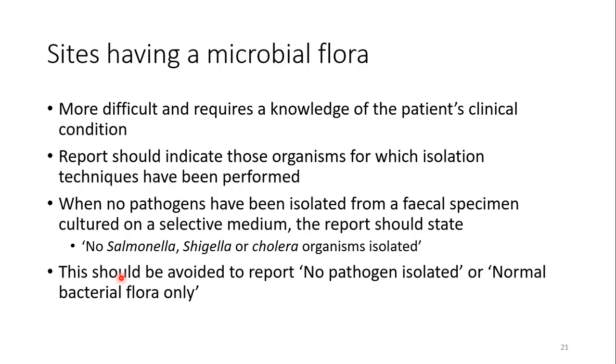Certain things should be avoided in reporting. For example, if no pathogen is isolated from the fecal specimen, you should avoid reporting "no pathogen isolated" or "normal bacterial flora only." These wordings and sentences should be avoided.